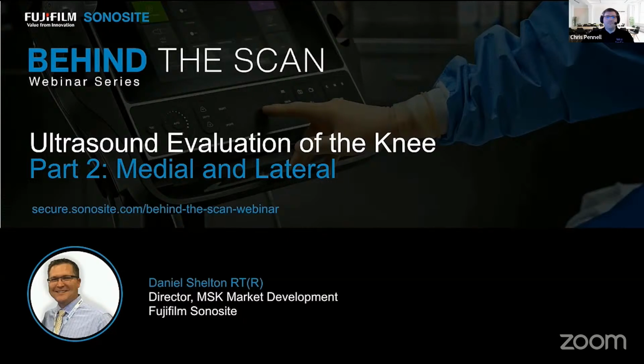Thanks, Chris, and excited to be here. This is one of my favorite topics to discuss because I think there's a lot of challenges when evaluating the medial and lateral knee. As easy as the anterior knee was, this one is just a bit different. So we're gonna take a different approach to how we look at the anatomy today, and I'm very excited to show you the pearls and scanning tips for the medial and lateral knee, especially those collateral ligaments, and the PES complex, which I think is pretty mysterious for a lot of people when they're learning this. So hopefully we're catching you early in your learning curve and you can get some of these tips and take them straight to your clinical practice.